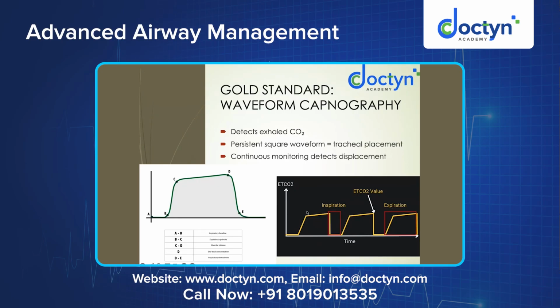It is not one, because if you see only 1 or 2, the air which got insufflated into the stomach while we are doing bag mask ventilation will come out through the tube we have placed in the esophagus. So 1 or 2 normal waveforms also might come even if the tube is in the esophagus. So that's why a minimum of 5 to 6 waveforms are required. The EtCO2 waveforms are required for ventilation, and only that confirms your endotracheal tube placement.